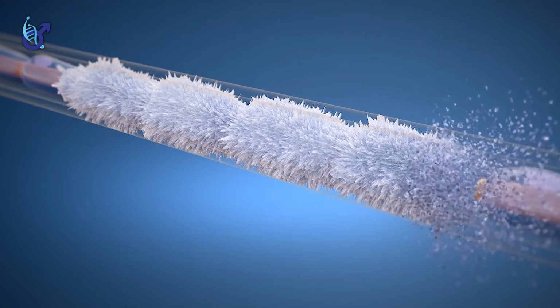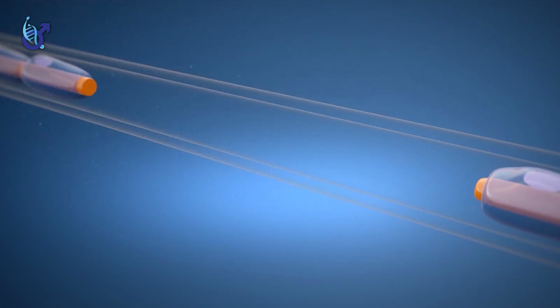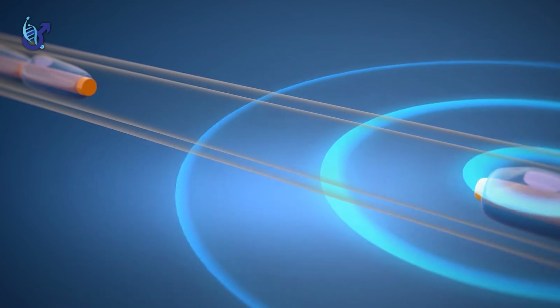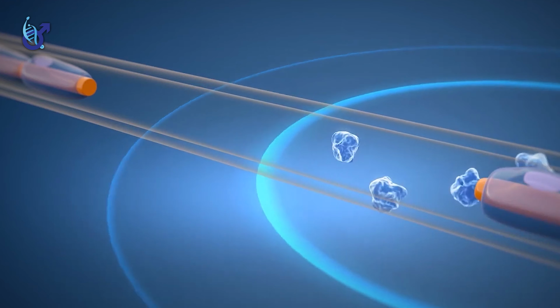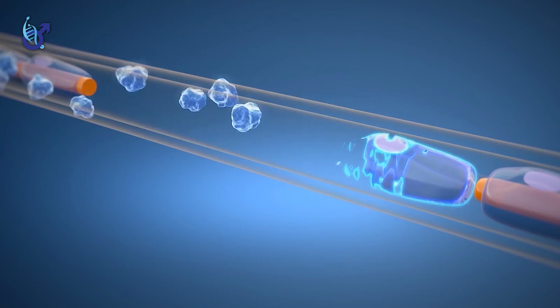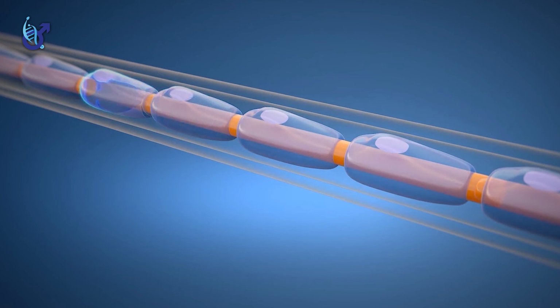By the effect of the cryoablation, the myelin sheath, the sheath which is covering the sensory nerves of the penis, is destroyed and degenerated. And after this degeneration, the body regenerates its myelin sheath, but the degeneration and regeneration phase generally takes around 1 to 2 years after the application. Regeneration is a millimetric procedure, and it takes time, slow and slow and slow. This slow regeneration time teaches our body how to control its ejaculation.